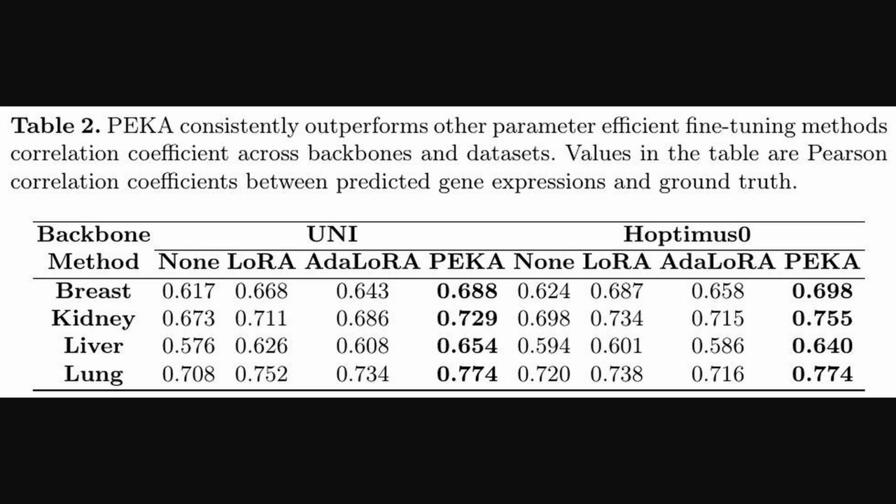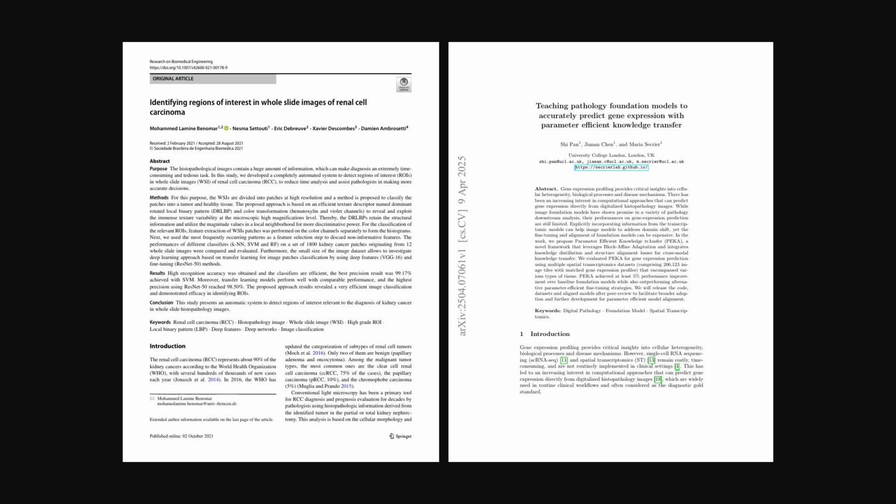This suggests PEKA is really effective at bridging that modality gap and letting image models understand molecular information better, all while being computationally efficient. I think this is really significant. It opens doors to potentially extracting rich molecular data from routine slides, which could be huge for research, and maybe even clinical applications down the line.